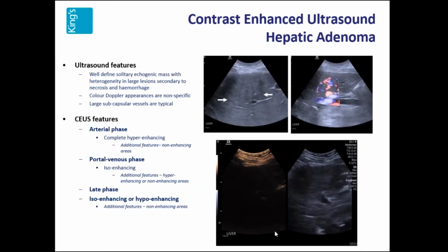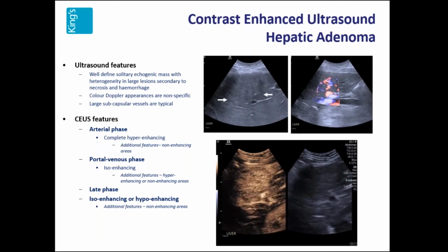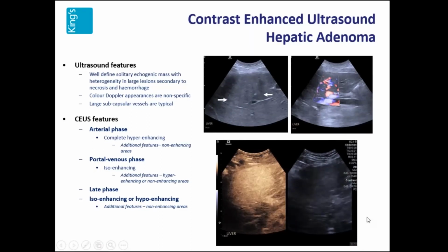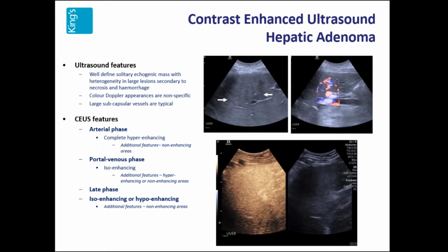Hepatic adenomas behave slightly differently. They can be quite subtle, that you may not see it so clearly, and it's also rarer than a focal nodular hyperplasia. And look at this adenoma. It filled very differently from the FNH. These two should not wash out, but it's becoming more clear that the pathophysiology, the pathology of these lesions are different, and there may be some washout, the hallmark of malignancy, which may confuse the situation.